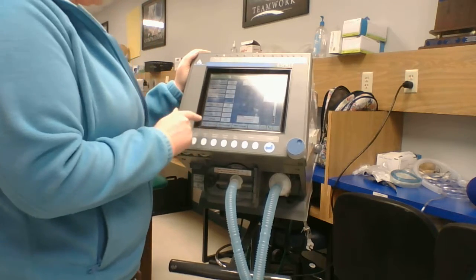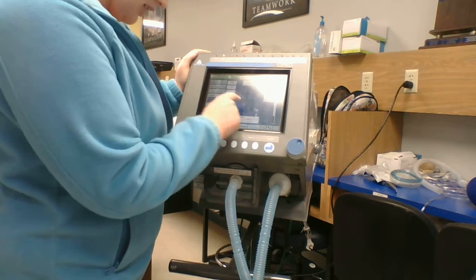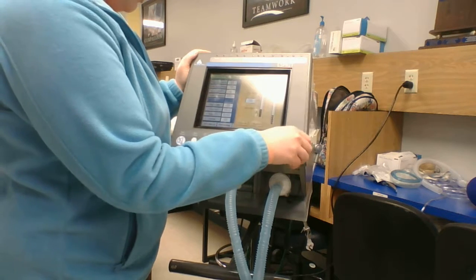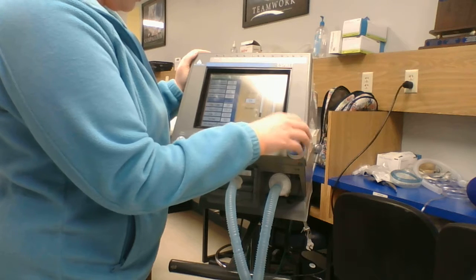My alarm settings. So my high pressure setting, I want that to be, my PIPs are at 12.4. So I'm going to turn that down to about 23.